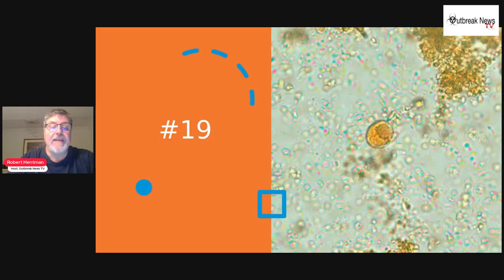An important diagnostic feature of this species is the presence of a large, compact vacuole of glycogen in the cyst stage. Although this mass can be visible in unstained wet mounts, in iodine-stained preparations, it takes on a darker reddish-brown color. The glycogen vacuole does not stain with trichrome, but is visible as a well-defined mass.